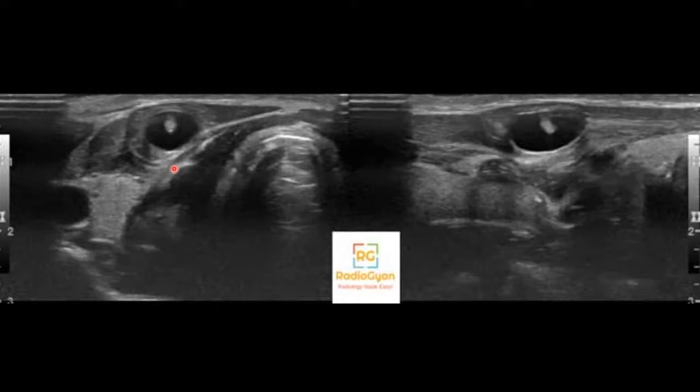So yeah, Sayani rightly pointed out, on radiographs what we see is typically rice grain calcifications. The other interesting thing is that these patients usually have extensive multisystemic disease. So if the patient also has CNS symptoms, always recommend a CT.